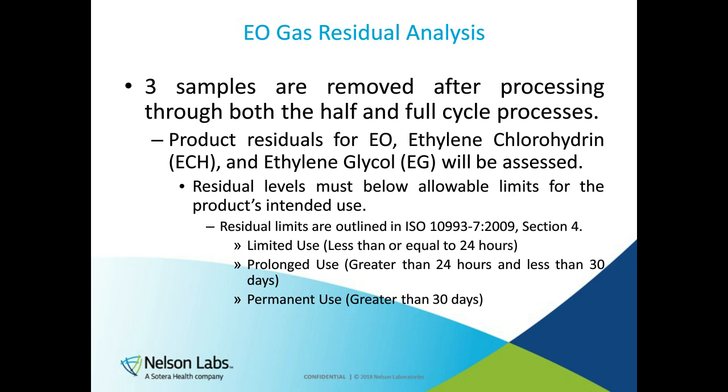We evaluate all 3: EO, ethylene chlorohydrin, and ethylene glycol residuals. Only the ethylene oxide and the ethylene chlorohydrin have requirements to be within a certain level or limit of residue.